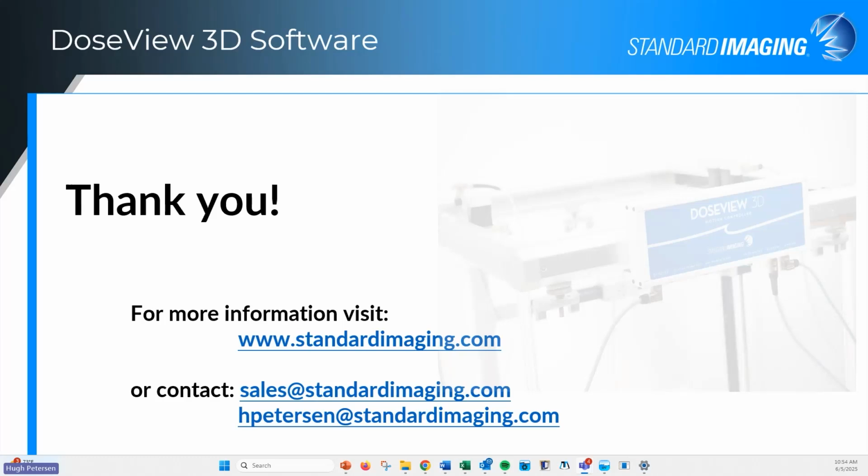Not really that I'm aware of. You're still doing mostly a static beam in the Halcyon. So your profiles and your depth measurements, but I'm not aware of anything specific outside of just what you're doing with your conventional scanning. Awesome, thank you.